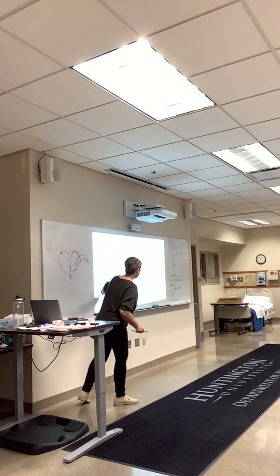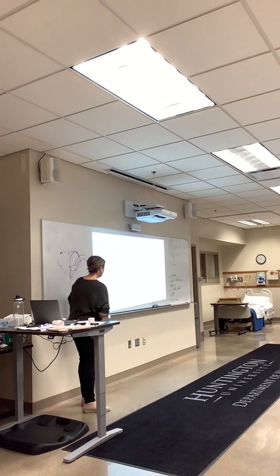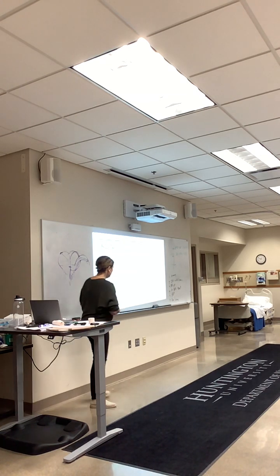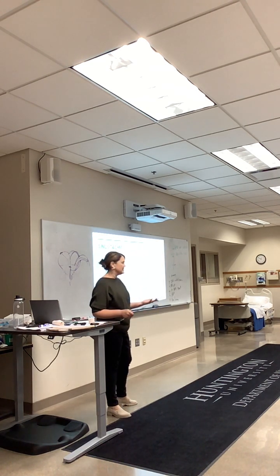So I've got that. My PR interval's okay. Do I have a P wave for every QRS? Yes, I do. Don't worry about these other bumps. What are those extra? That's just a T wave. You go through it: P, QRS, T, P, QRS, T, P, QRS, T. Don't think, ooh, that's a weird thing. You have an equal number of waves, exactly what you're expecting.